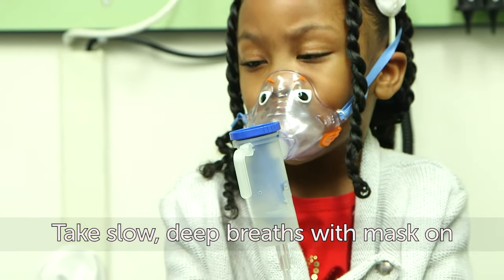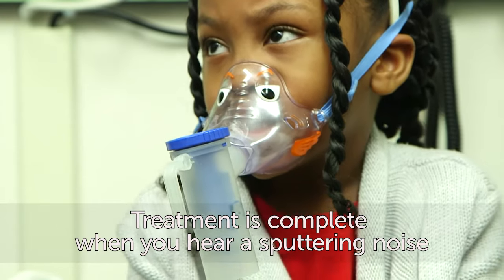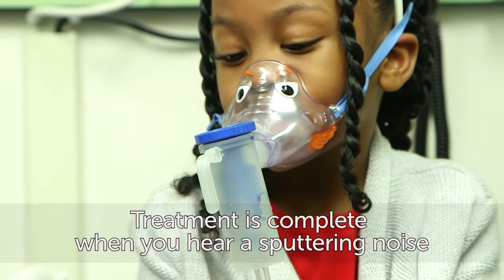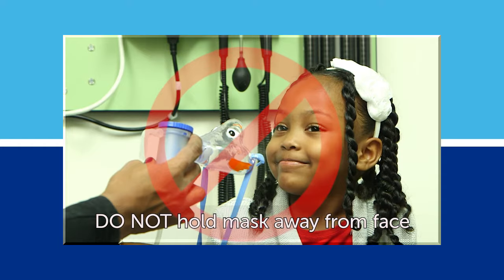The treatment will take six to ten minutes. You will know the treatment is complete when you hear the sound change to a sputtering noise — there will still be a little medication in the container. Do not hold the mask away from your face while breathing in the medicine.